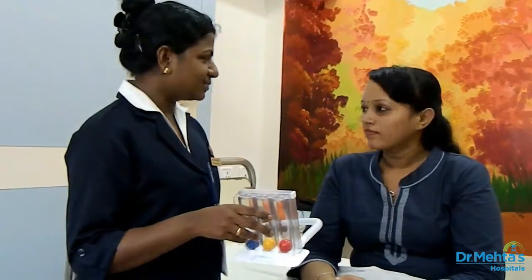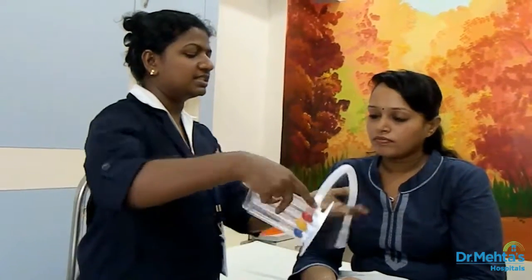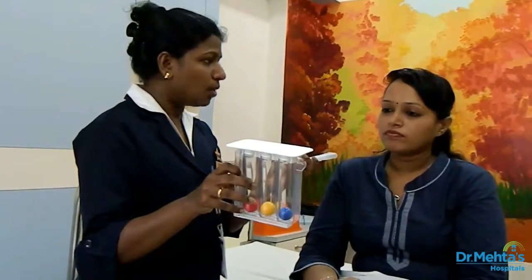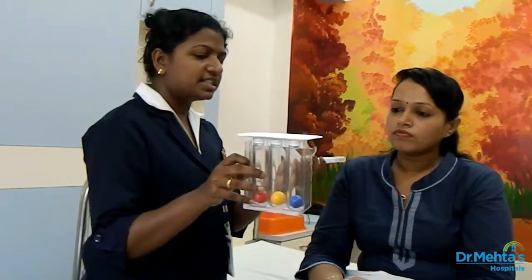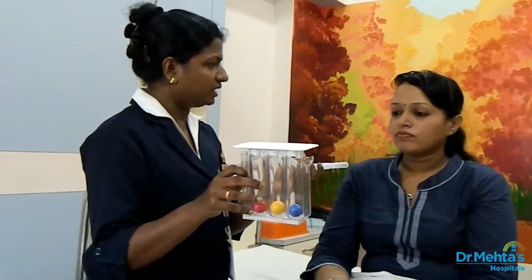Now we have done the inspiration. Let us see how to do the expiration exercise. All you have to do is you have to tilt this spirometer and you have to blow up the air so that the balls in the spirometer will go up and stays. This also you have to continue for 10 times.